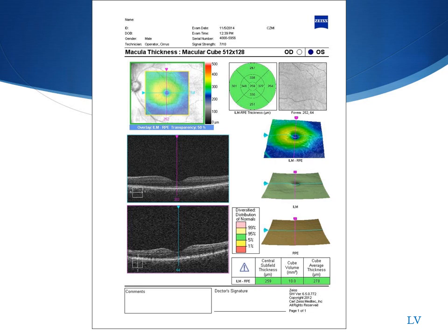This is the macular cube 512x128. It's important to identify that the patient information is correct, especially date of birth, because the macular thickness is based on a normative database. In the upper left-hand corner, you'll have your ILM/RPE overlay. Any areas of elevation or depression will show up on the scan. If the area is thickened, you can see that it will fall between 400–500 microns — it'll be orange, yellow, or red. The thicker the layer, the warmer the colors.